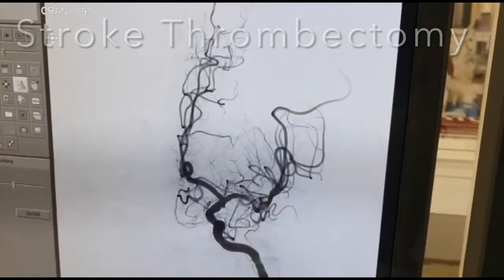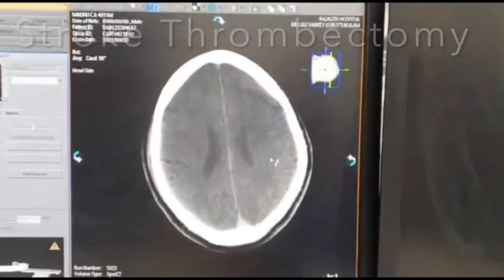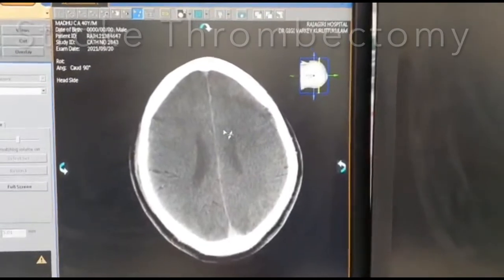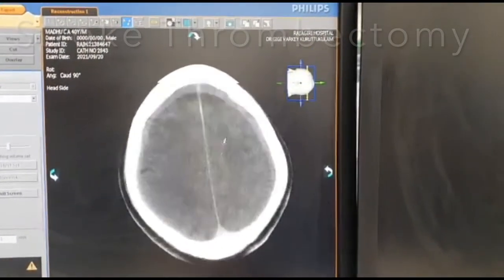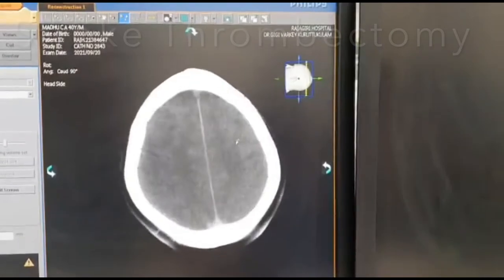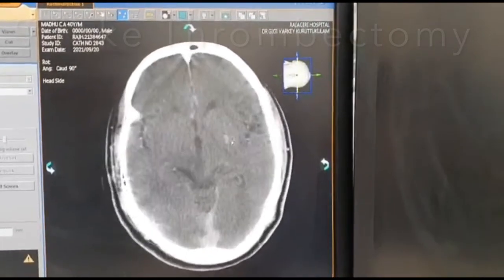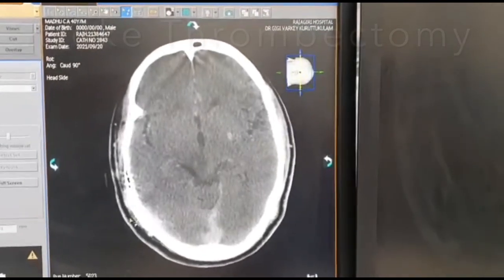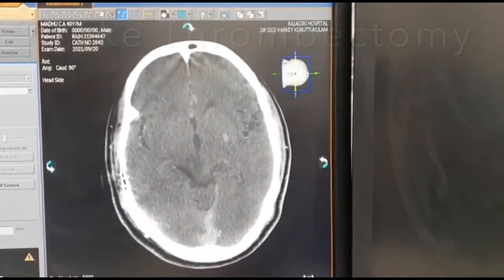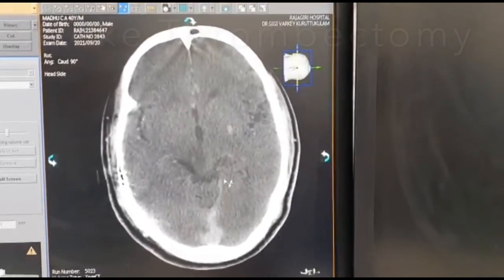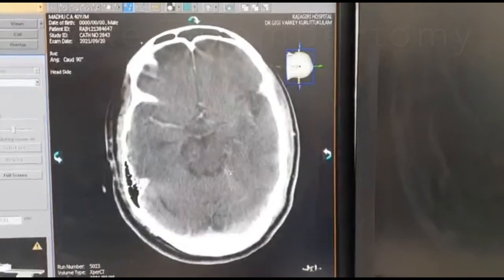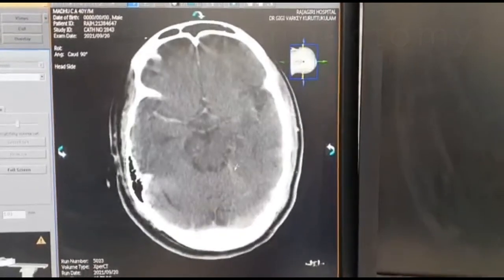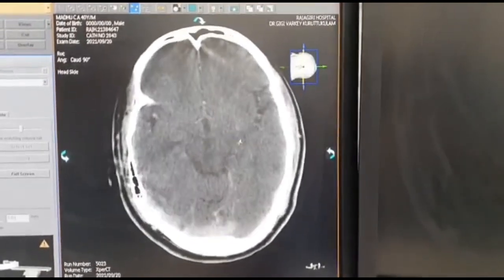A CT scan was done immediately after. This is the flat-detector CT done inside the cath lab itself, which checks for any bleed. There is no bleed. The sinuses are seen prominently because of the contrast used for the angiogram — this is more like a post-contrast CT. You can see the blood vessels clearly. No bleed.